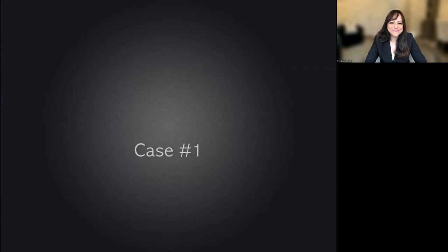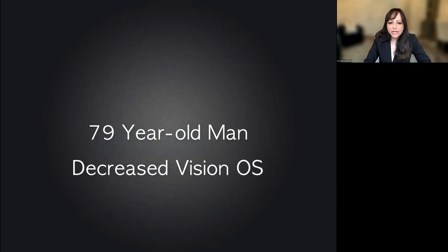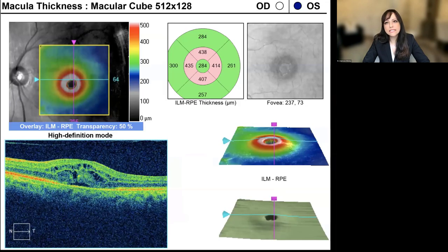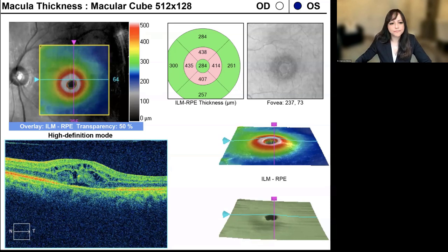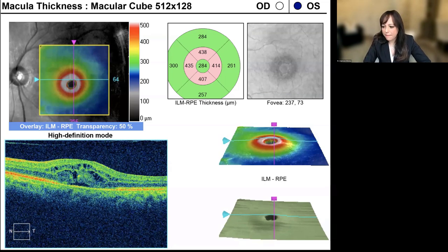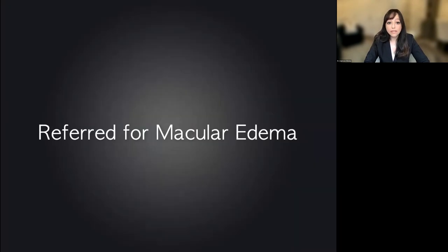Case number one: a 79-year-old man with decreased vision in the left eye. This is the OCT as presented in the clinic. Audience responses included macular edema, cystoid macular edema, choroidal neovascular membrane, and macular degeneration. This patient was actually referred for macular edema in the left eye.